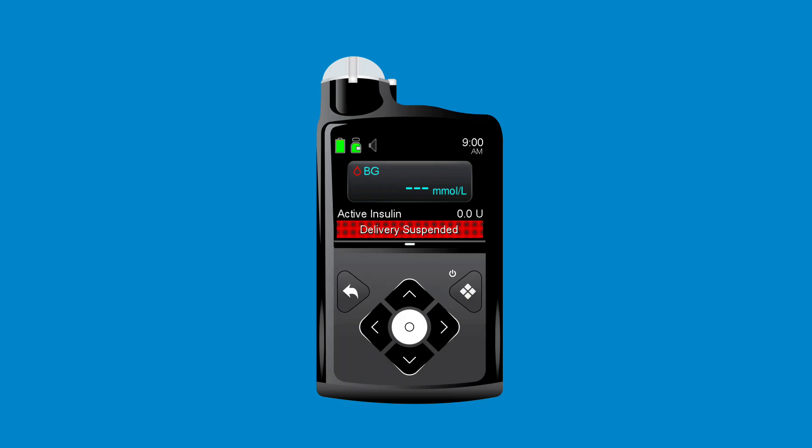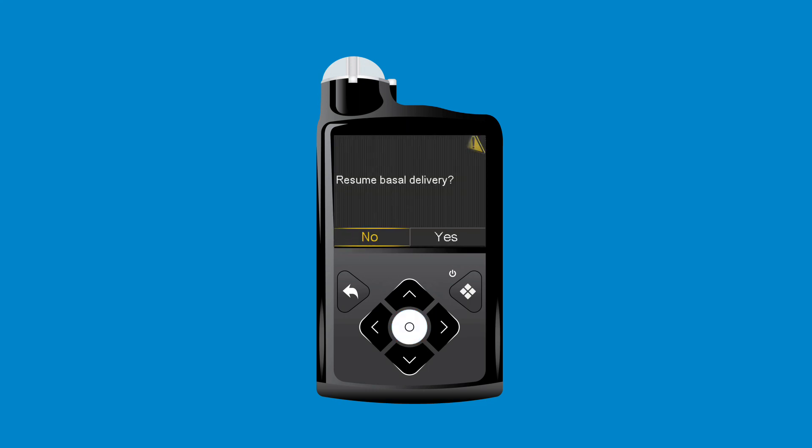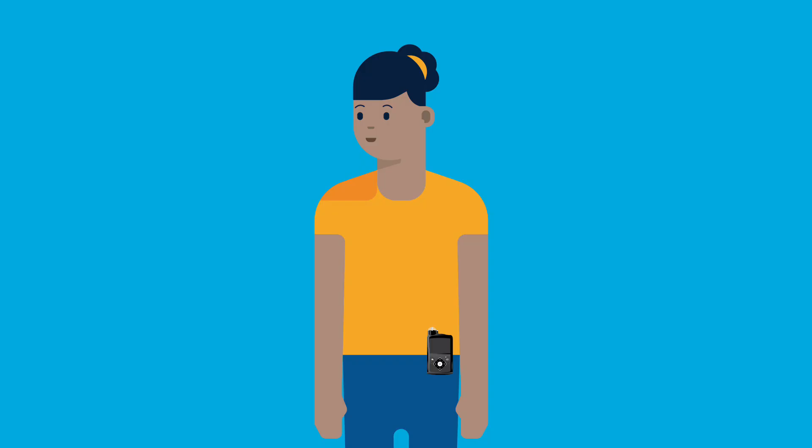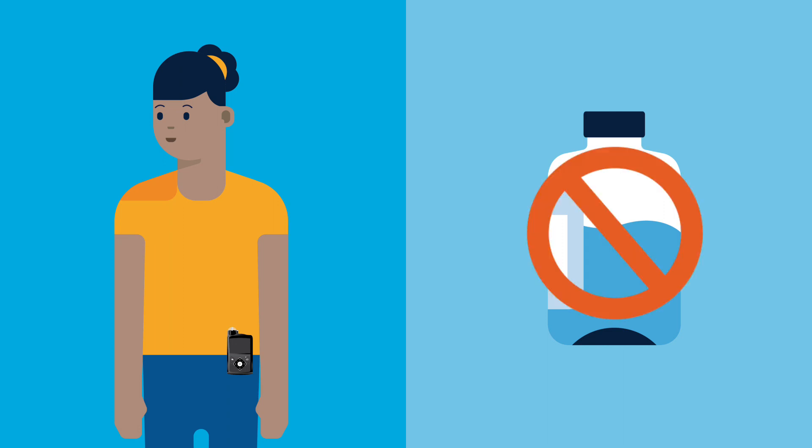To resume delivery, Anna presses Select to open the menu. She selects Resume Delivery, presses right, and selects Yes. The Delivery Resume Successfully message appears. When she resumes, the pump will start to deliver basal insulin again at the programmed rate. The insulin she didn't receive while the pump was suspended will not be delivered.